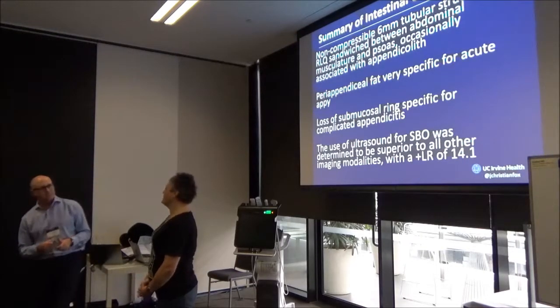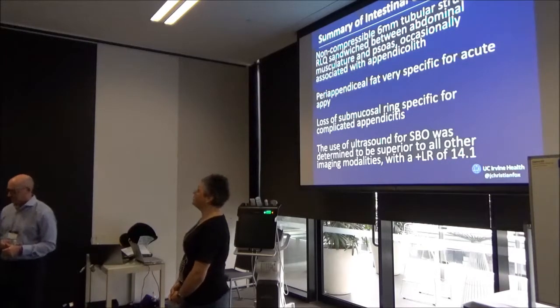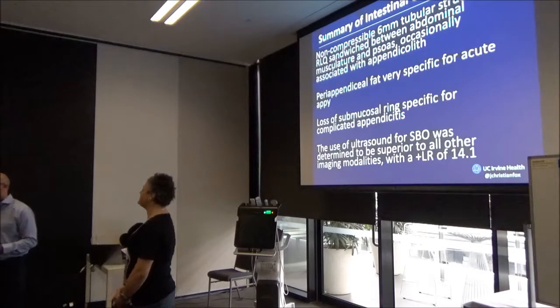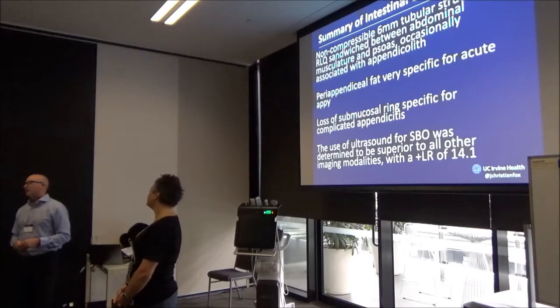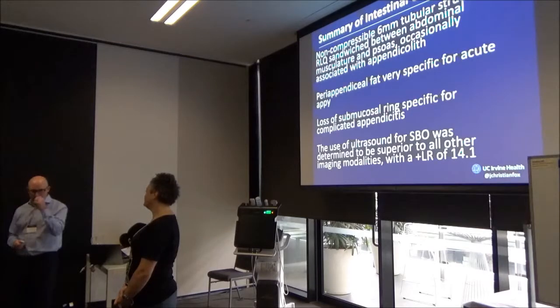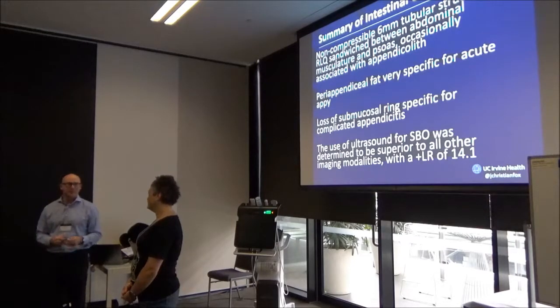Does it take longer on a bigger BMI person, time-wise, or do you think that's related more to your level of experience in terms of just your scan technique and your confidence level? Yeah, both things are important here. BMI and also your level of confidence in your technique is important. I think certainly with larger BMI, these things take longer to do for sure. You have more ground to cover.